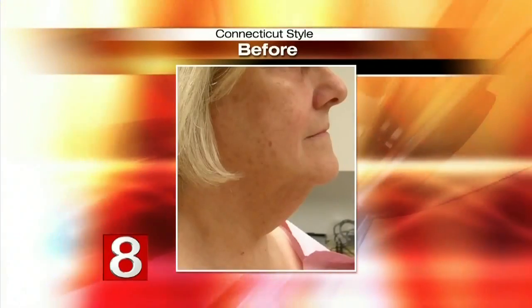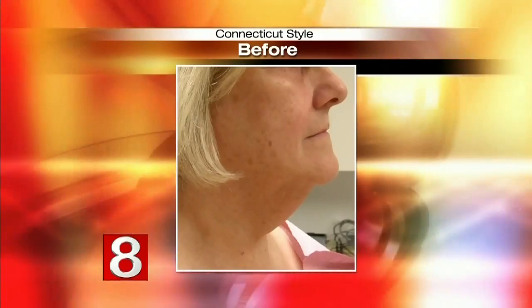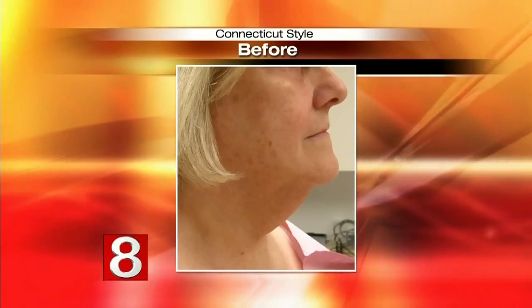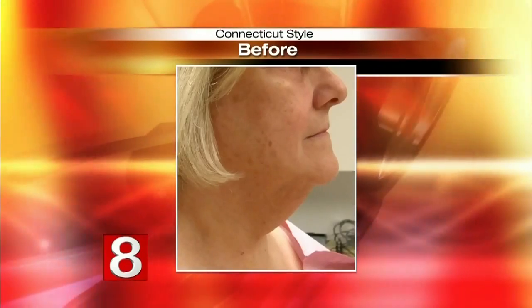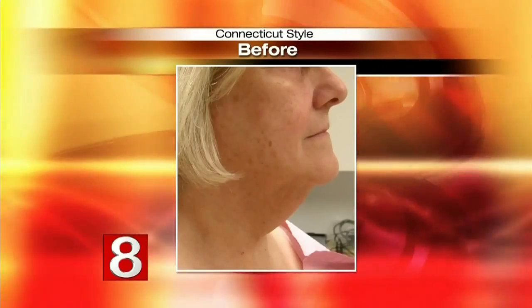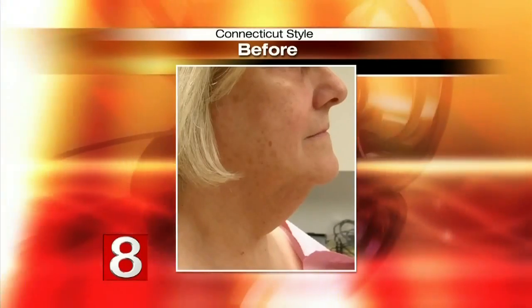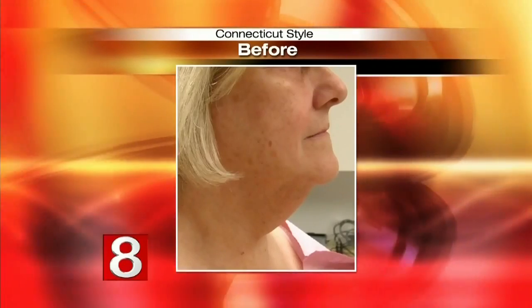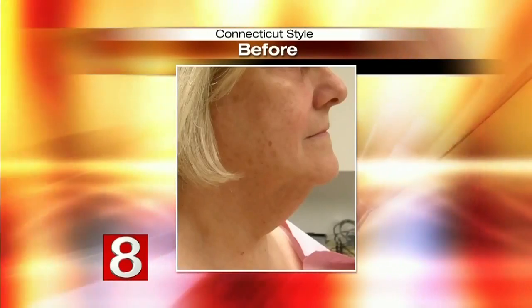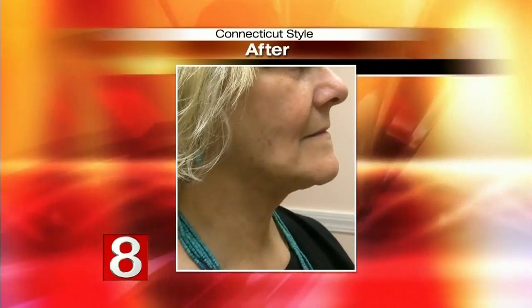Well, you always bring along some great before and after pictures. We have some here today. If we could pop them up on the screen. Just explain to us what we're looking at, Doctor. This is a patient that has a pretty significant amount of fat in the area of the neck, especially below the chin, and also some prominence in the jowl, which is the lower cheek area to the side of the chin. So in her case, we combine liposuction of the neck and the jowl area with the ThermiTight. And we're able to use the same small incisions that we use for liposuction in a case like this. Someone that would have less fat may not even require liposuction, and it would just have the ThermiTight delivered.